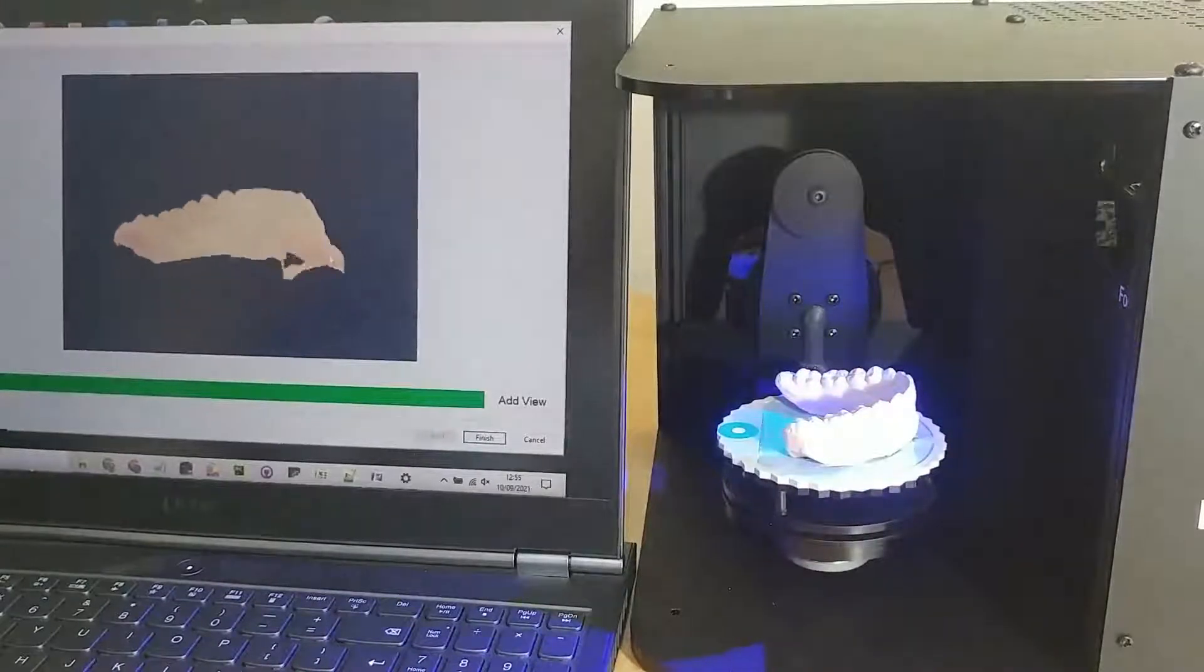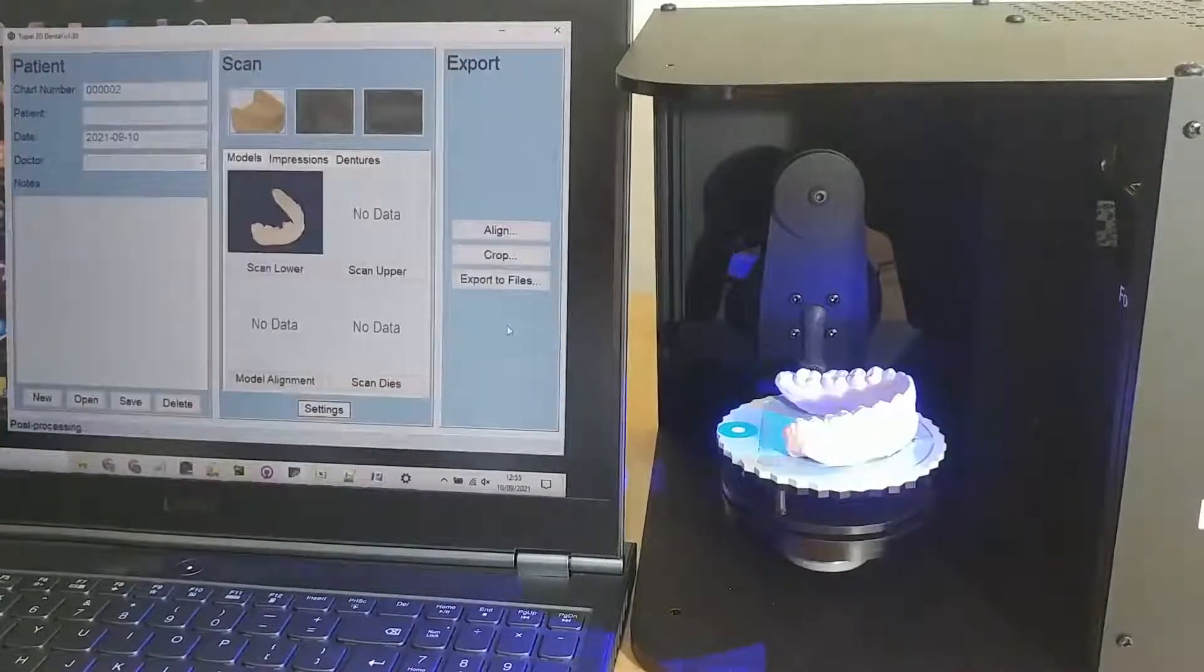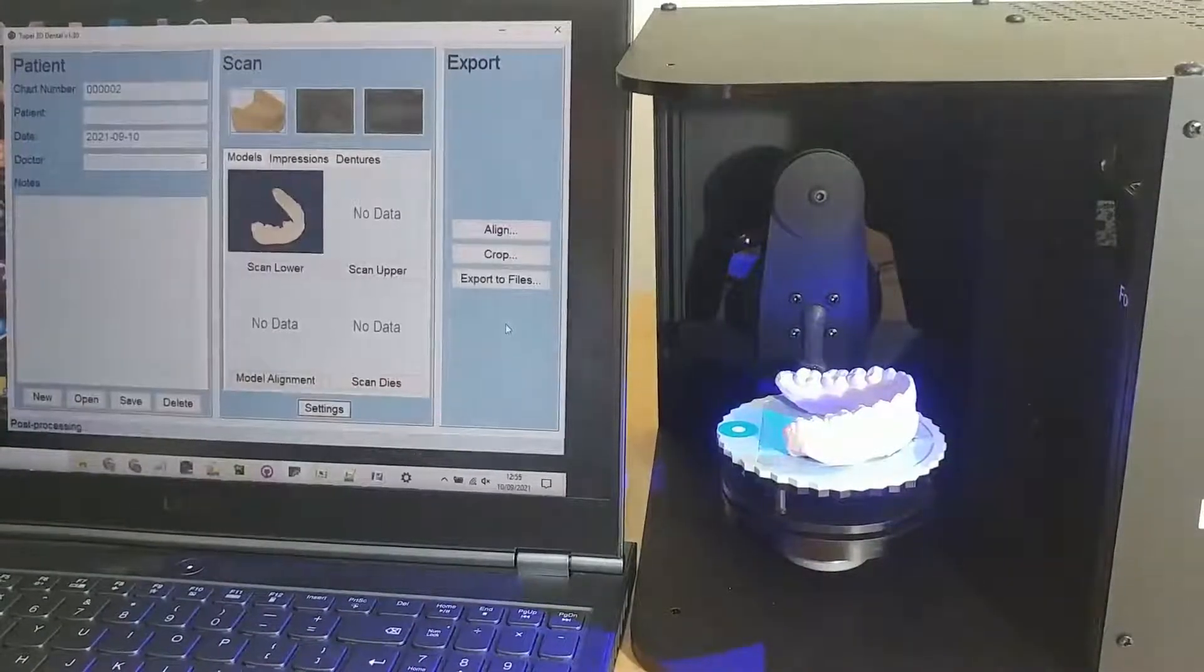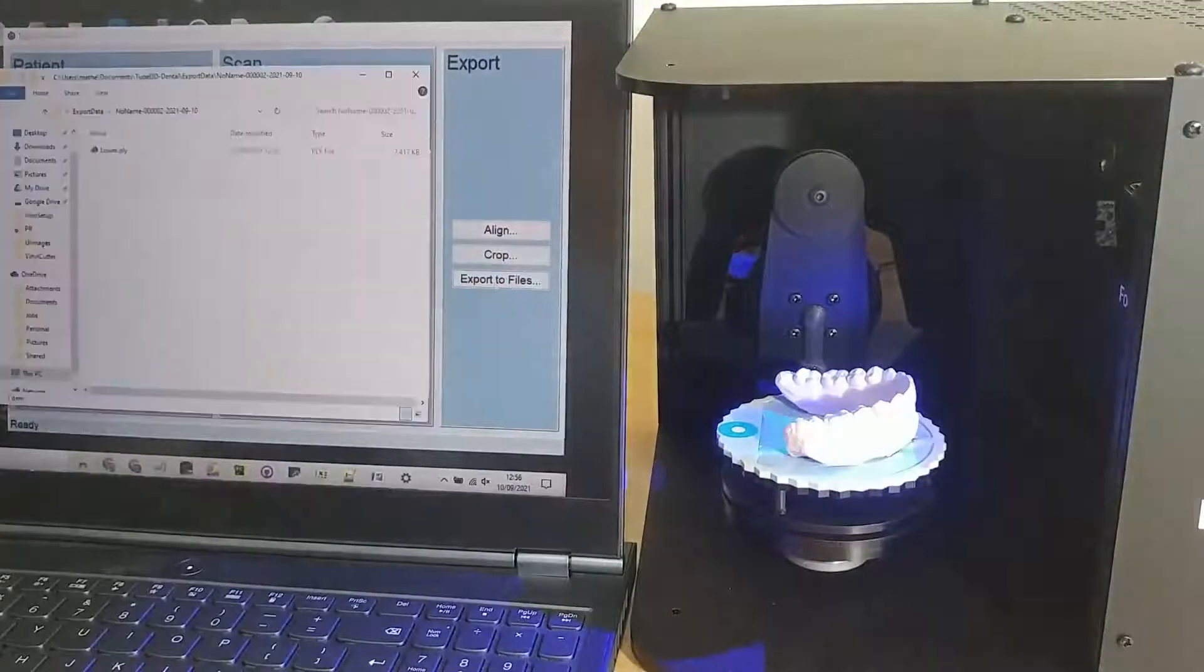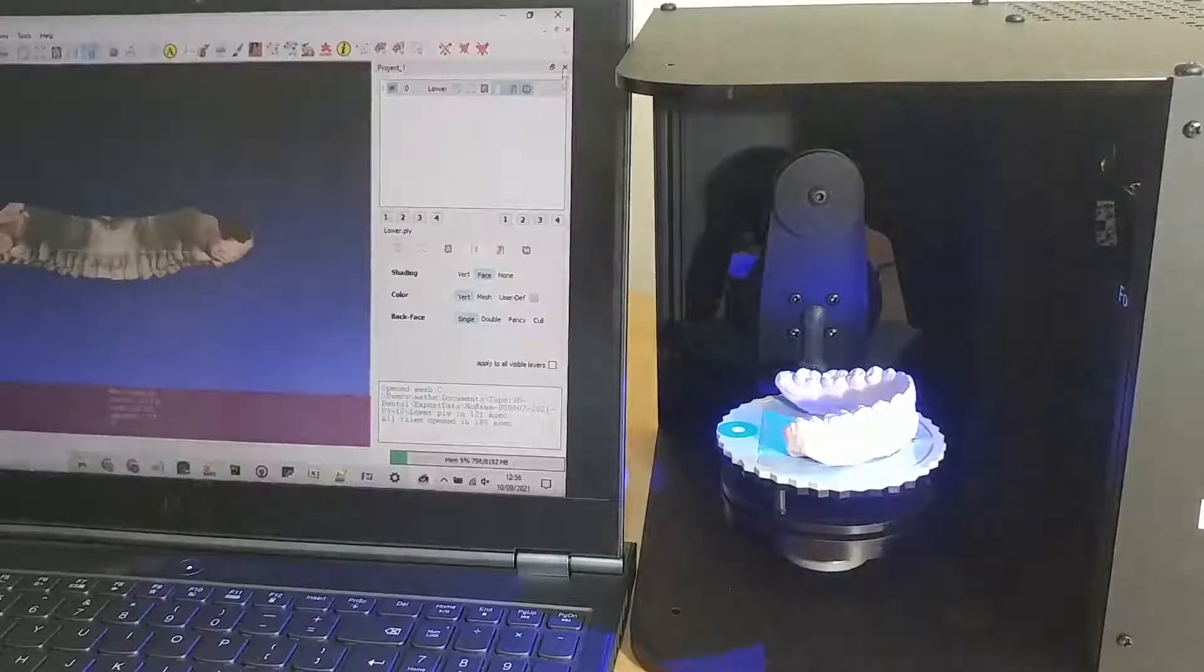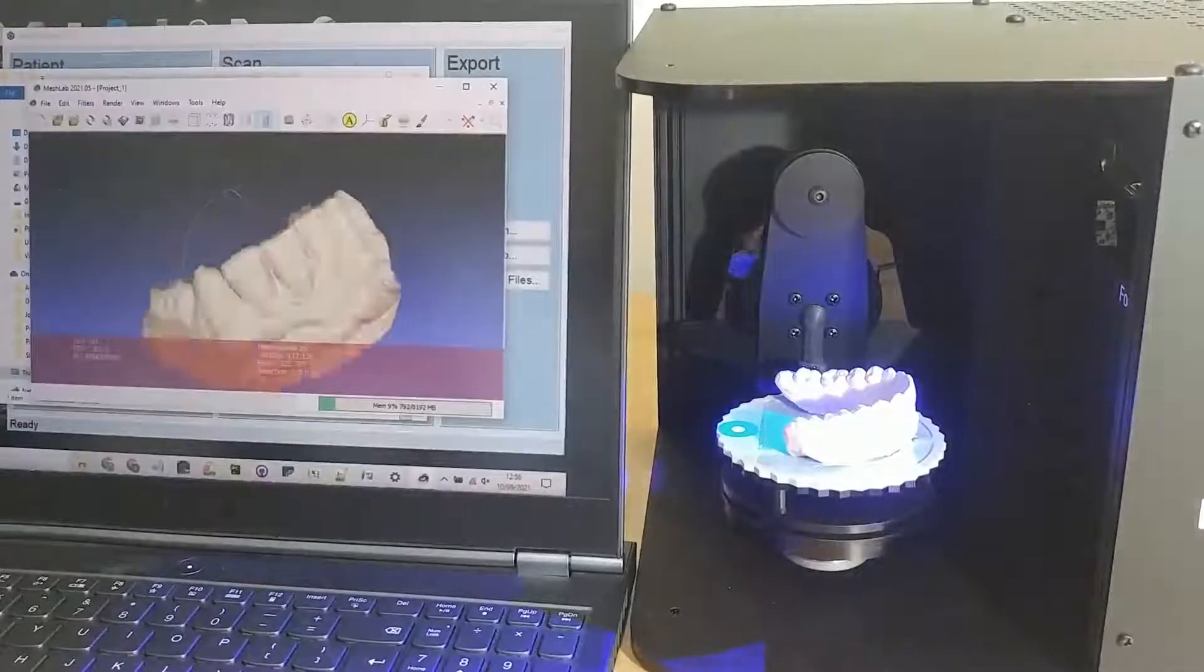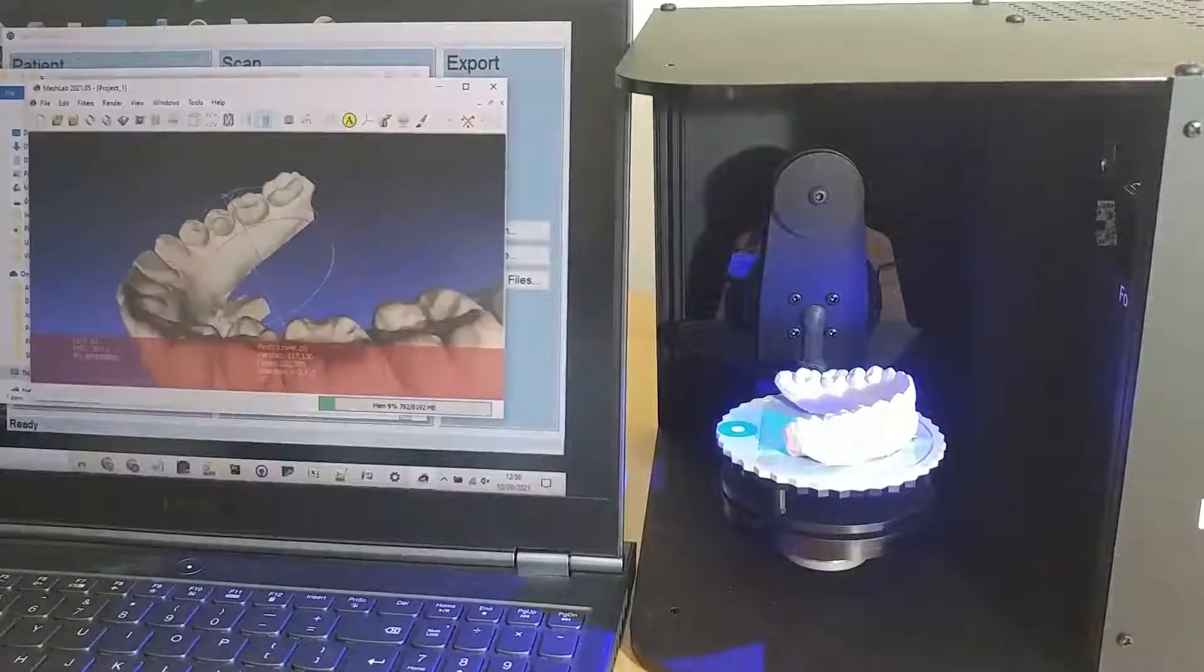So now the scan's done I can click export to files and I can load the scan into any software I like. You can see it there in MeshLab.